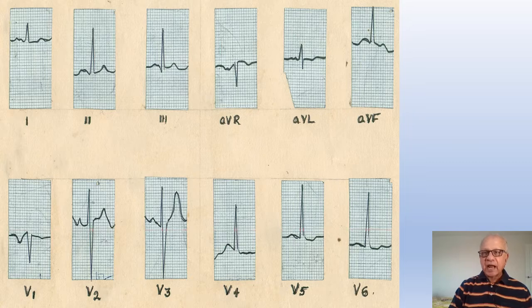So this patient had an isolated left atrial enlargement without left ventricular hypertrophy, and the commonest condition we encounter clinically in India is always rheumatic mitral stenosis, isn't it? This lady had a tight mitral stenosis which was operated with a mitral commissurotomy, and she was relieved of her symptoms. This was about 30-40 years ago, when we did not have the facilities for the balloon valvotomy which we do today, and hence we had to resort to a surgical commissurotomy.